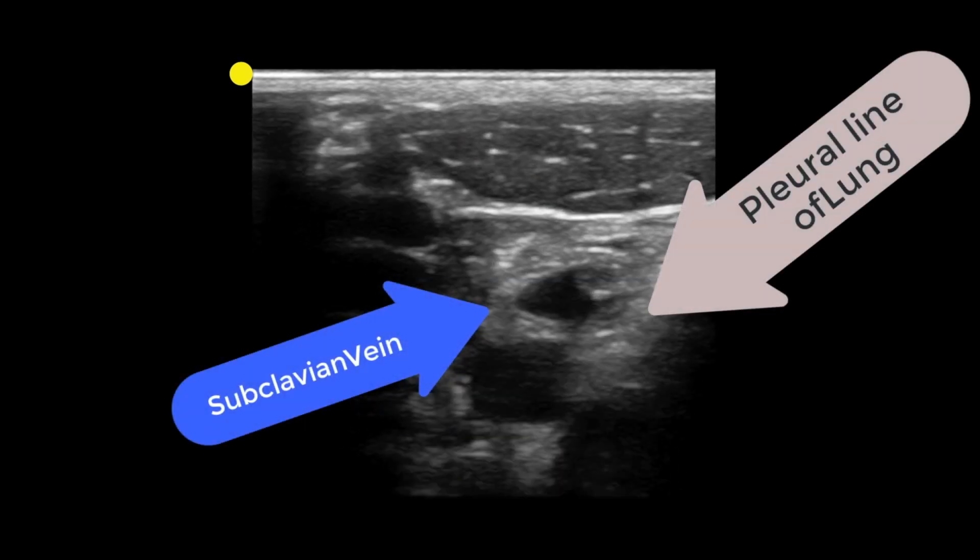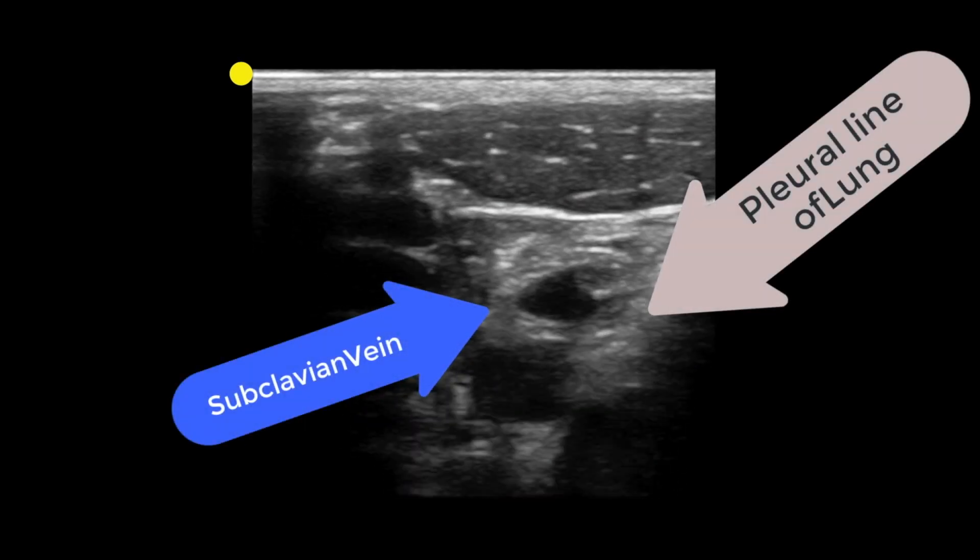Look at the clip on screen. Notice just how close that subclavian vein is to the pleural line of the lung — it's so close, and it gives me pause that whenever I need to place a line, ultrasound is totally the way to go. Here's the key to the entire procedure, and I say this to trainees and attendings alike: you should never, ever, under any circumstances, do this in the short axis or cross-sectional view.